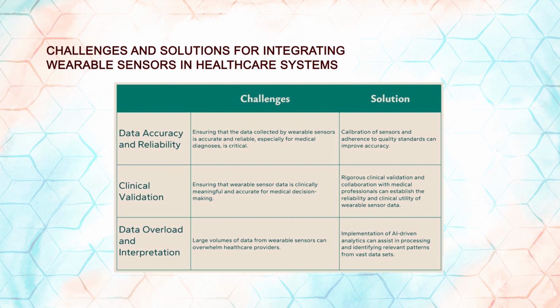The next one is clinical validation. Its challenge is ensuring that the wearable sensor data is clinically meaningful and accurate for medical decision making. Its solution is rigorous clinical validation and collaboration with medical professionals, which can establish the reliability and clinical utility of wearable sensor data.